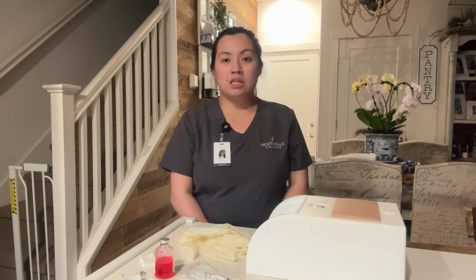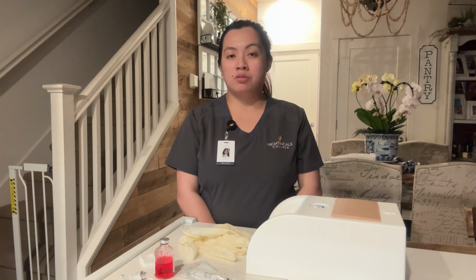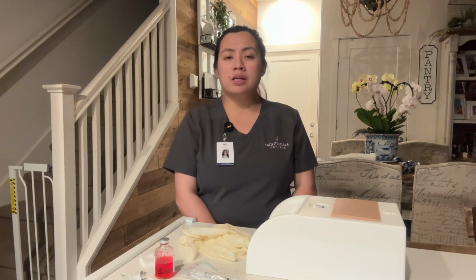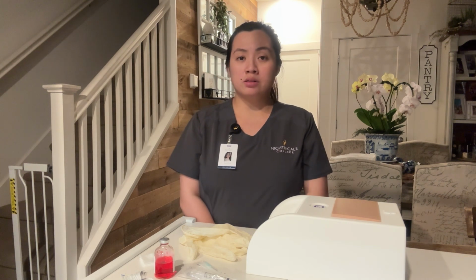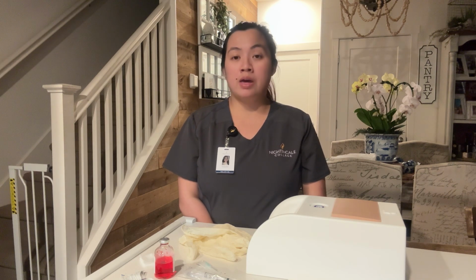Hello, my name is Kathy, and I'm going to be your nurse today. Can you confirm your full name and date of birth? Okay. Do you have any allergies to medication, food, or anything else? Perfect. So your provider has prescribed heparin.